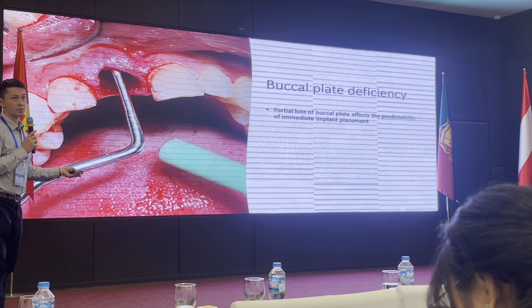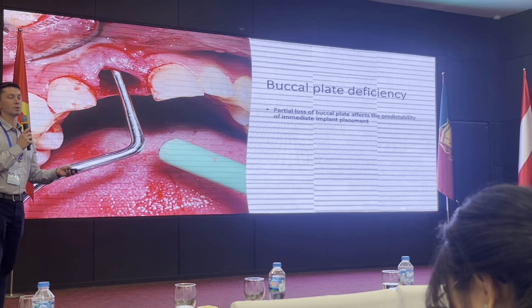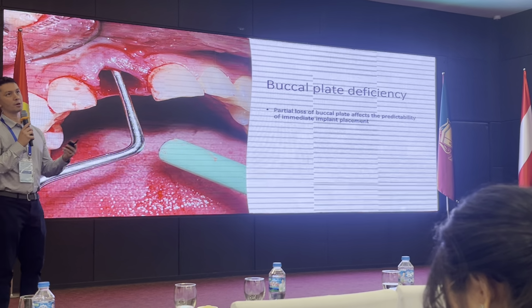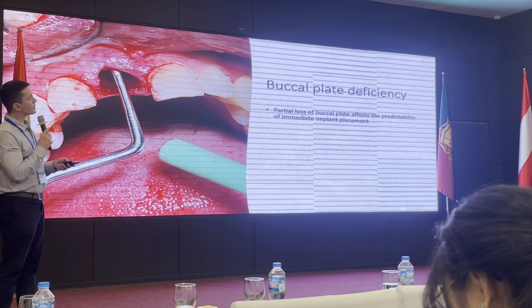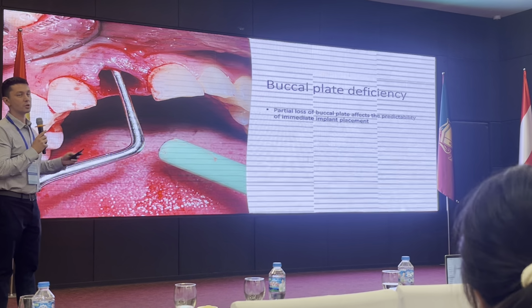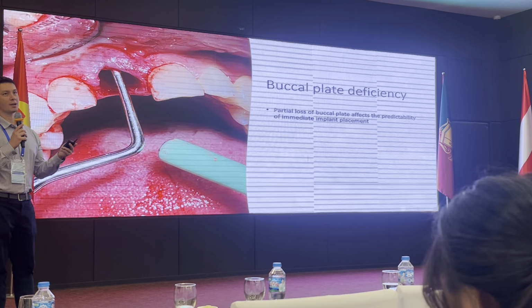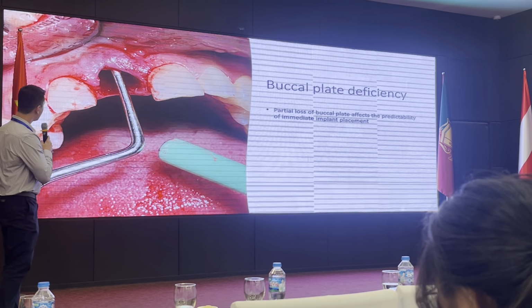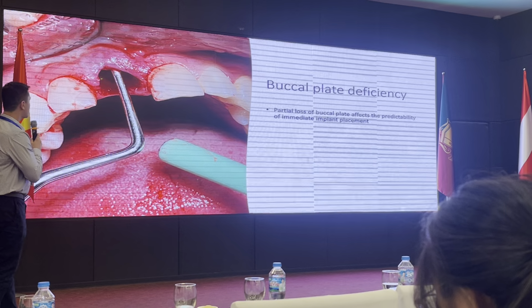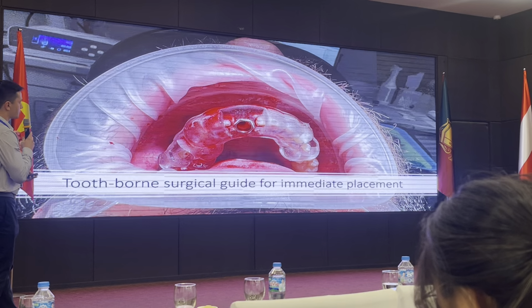Once the tooth is removed, we have to evaluate where the bone is. Sometimes the 3D cone beam shows maybe there's no bone on that buccal plate in front of the root. But sometimes there's actually a thin amount of bone that's really there, but the tooth was more dense on the x-ray, and so the density and the artifact scatter of the x-rays can affect what we see on a cone beam. We check the implant site to see where the bone is, check the soft tissue, make sure all the roots are out, and then we seat our surgical guide.